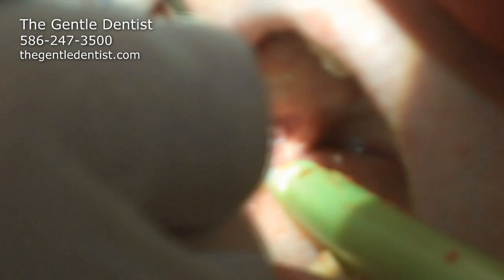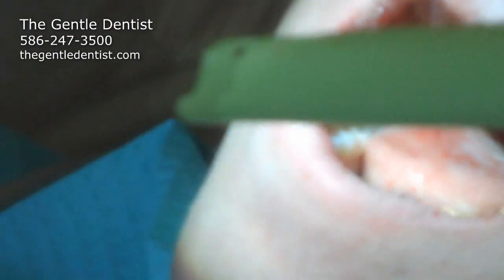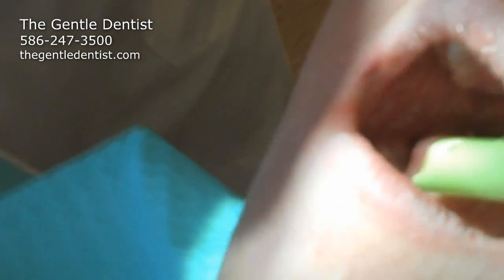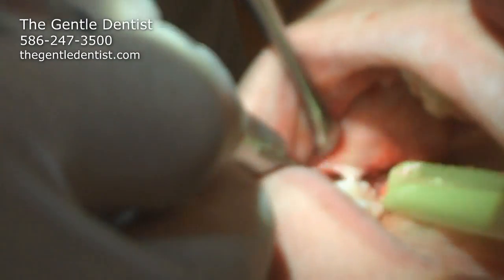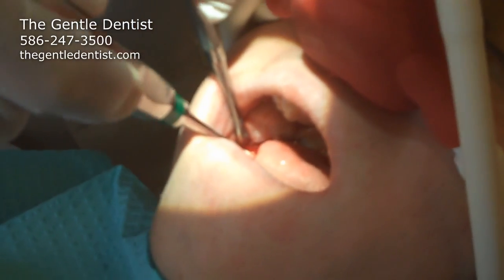And so I'm just removing a little of the bone around the tooth itself, so that I can basically gain access to it, and then go ahead and just remove that. Okay, Marshall? Good, thumbs up. Alright, you gotta make sure you're comfy here. Okay, we're just gonna create a little bit more of a window there for that. Okay, so, go ahead and suction it there.